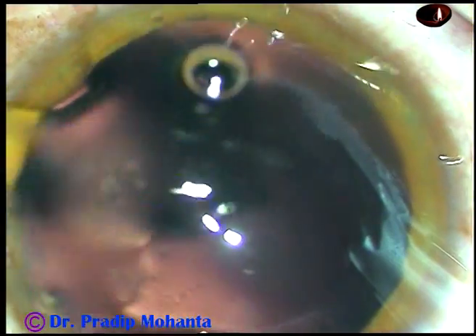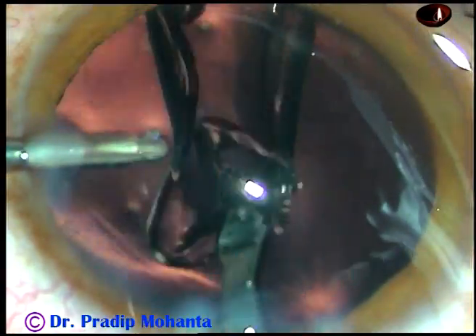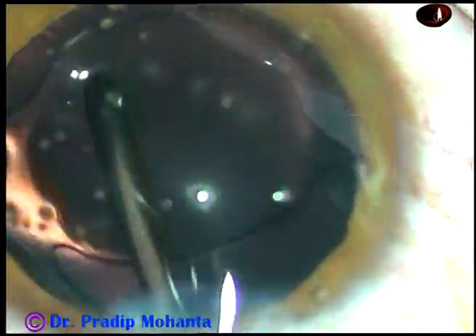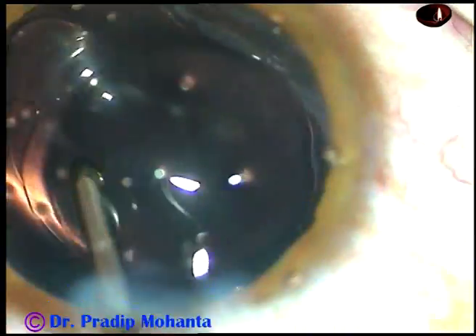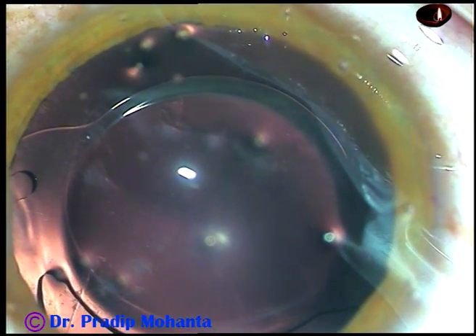And now, hydro-implantation. The lens is implanted in the capsular bag. The irrigating probe keeps the AC formed and places the trailing haptic in the capsular bag. The lens is rotated and the case is done.